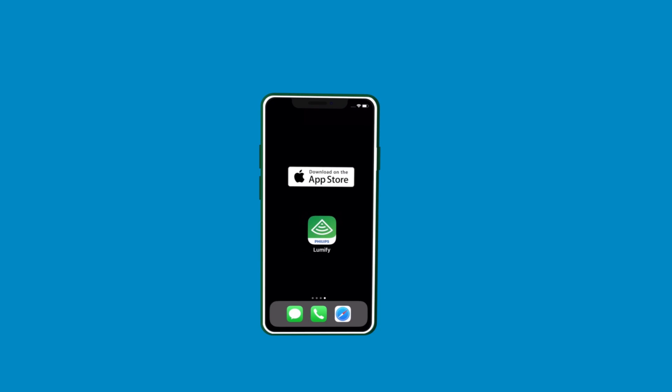Let's get started. First, make sure you have downloaded the Lumify ultrasound app from the App Store and placed your iOS device in your device case.